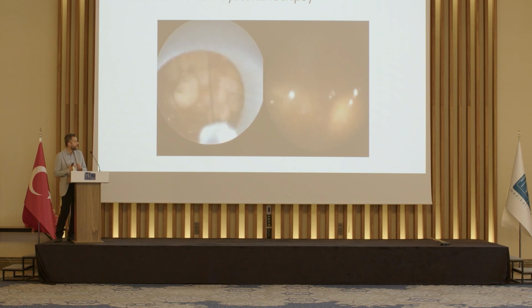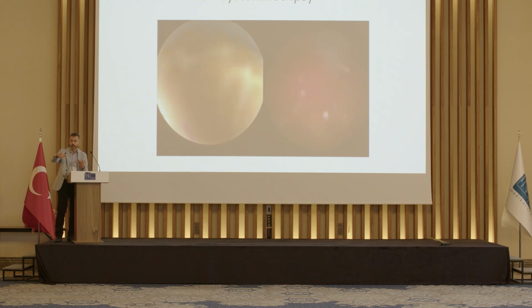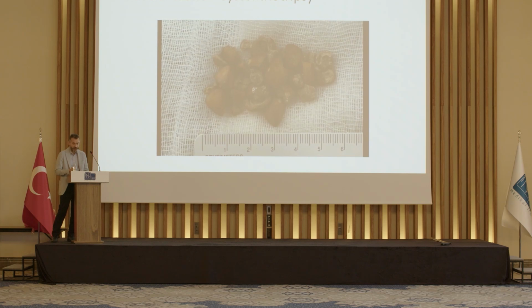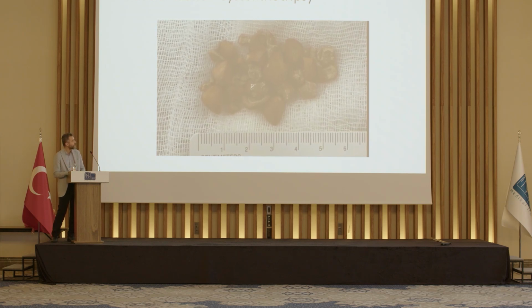So before we continue with the ballistic and take those pieces out, these are bladder stones, and we do not operate through the urethra. Instead, we put a suprapubic tube into the bladder from the skin and apply the lithotripsy from there in order to limit the trauma to the urethra. So in the end, as I mentioned, we need to know what the device is capable of, and by this way, it will be a much more efficient surgery.